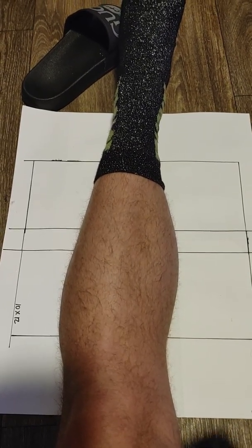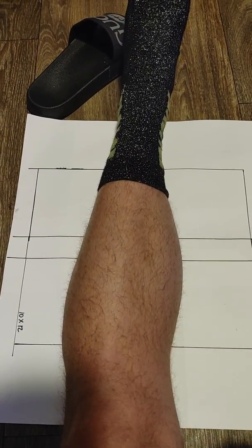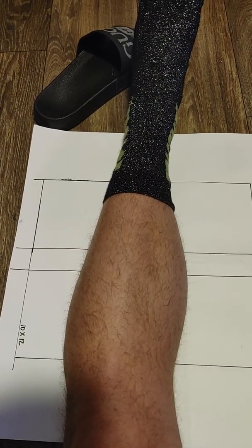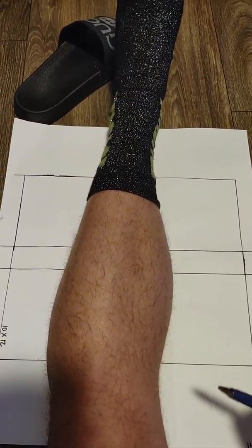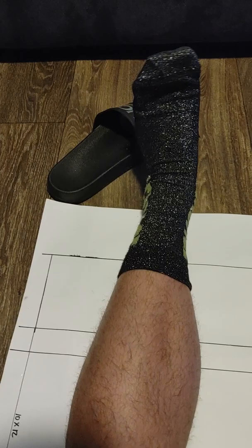This week we'll be doing views of the tibia, the fibula, and the knee. So to start with, for the tibia and the fibula, we have a 14 by 17 film. And to start with, we're going to use the AP view.